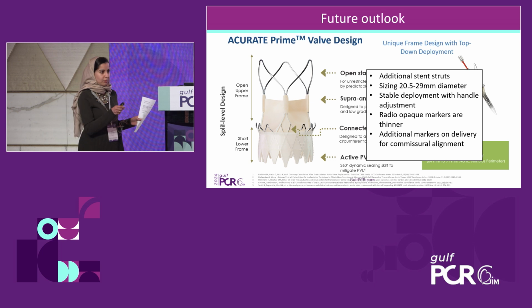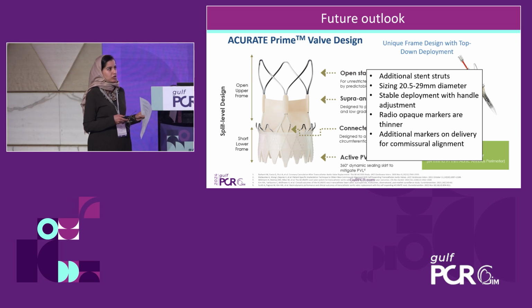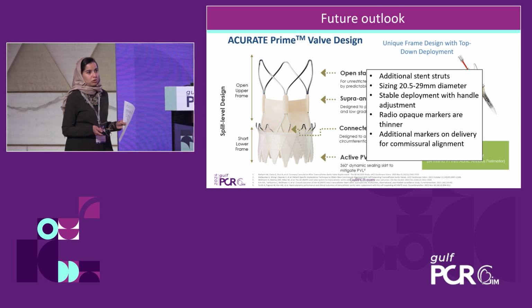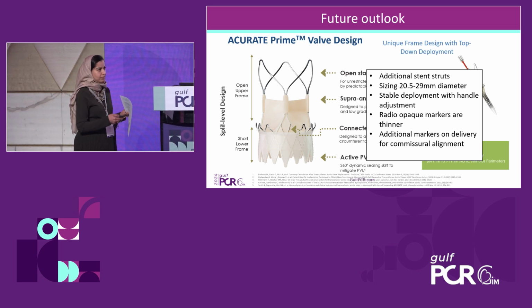There's going to be a more stable deployment, although it is stable now, but it's going to be even better with the handle adjustment. The radiopaque markers that we saw earlier will be thinner, so it will allow more precise deployment. And there will be additional markers on the delivery system for commissural alignment. So we'll stay tuned with the newer platform to see if there are any major changes in the clinical outcomes as well.